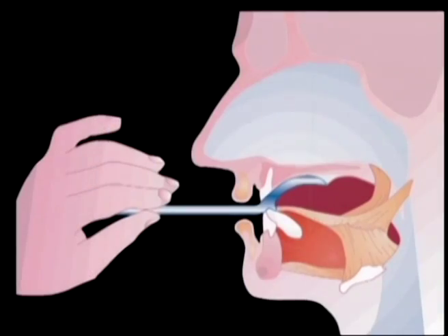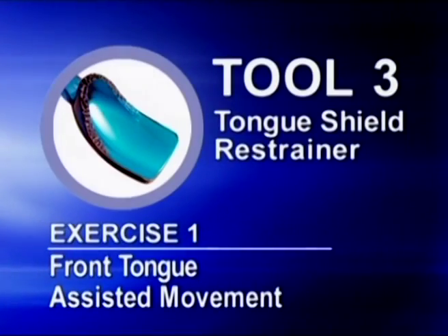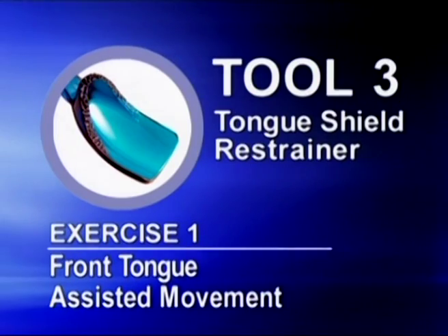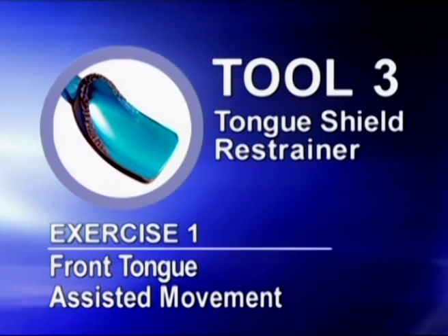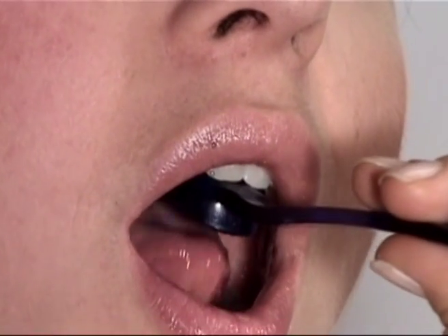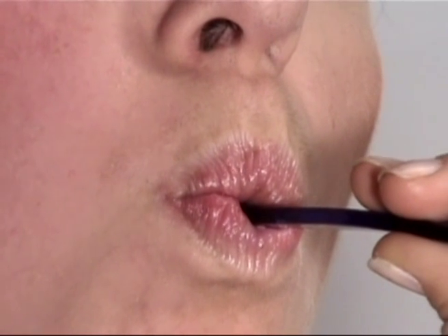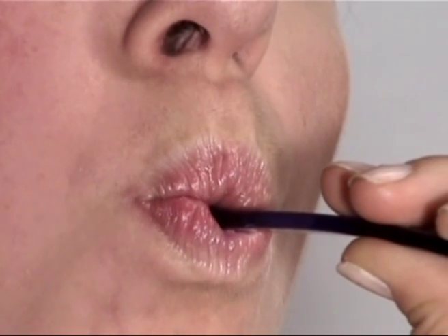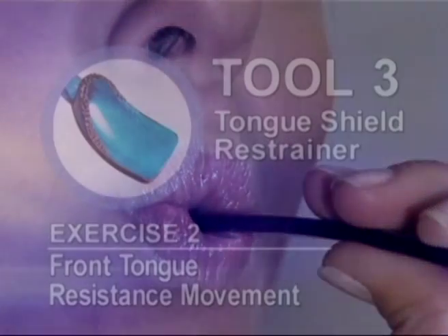Muscles exercised include genioglossus and intrinsic muscles of the tongue. The goal of exercise protocol 1 is to feel the tongue tip against the ridge of tool number 3 that shields the tongue from thrusting. The patient will press the tip of the tongue against the concave section of the ridge. Close the lips, and the patient should get the tactile sensation of an intraoral position while restraining the tongue from pushing or thrusting out of the mouth.